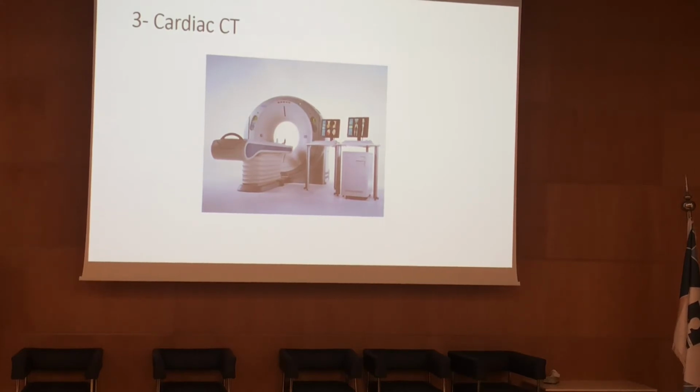Okay, so we'll move to the third one, which is cardiac CT. Cardiac CT is a very important tool for cardiopulmonary disease. We know the chest CT has been well established for a long time. However, cardiac CT, especially for coronaries, is something that emerged recently, I would say in the last 10 to 15 years.